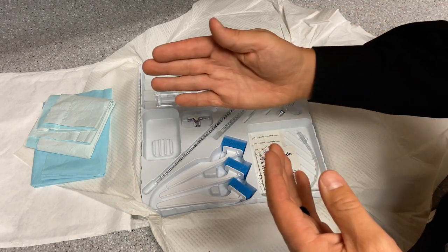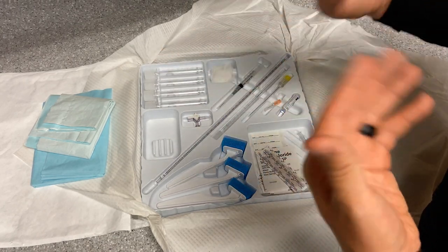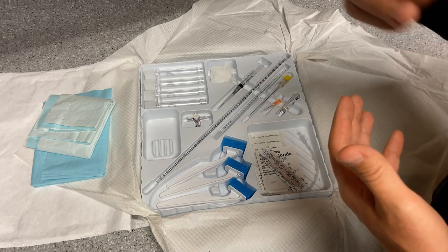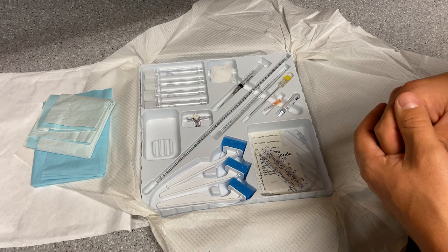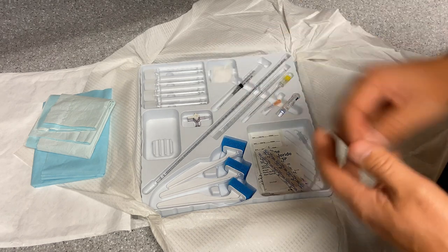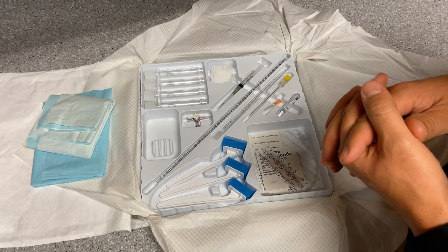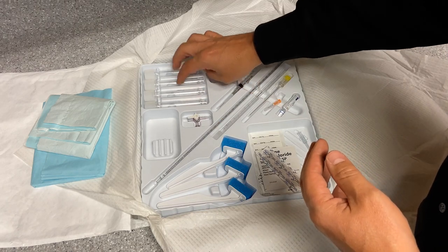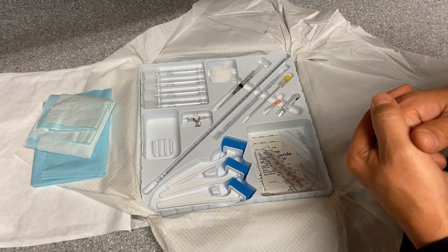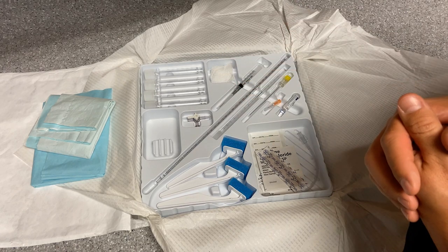A traumatic tap is when your first tube shows blood, but as you go through tubes one, two, three, four, you see it seems to be clearing up. That generally means your needle probably passed through some epidural veins and you're getting blood from soft tissue around the dura rather than from within the CSF. If a traumatic tap is believed to possibly be the reason for blood, you can repeat the cell count on vial four. Depending on the lab at your facility, the tube assignments may vary, but the most common pattern is cell count, protein and glucose, special tests, and gram stain and culture with possible repeat cell counts.